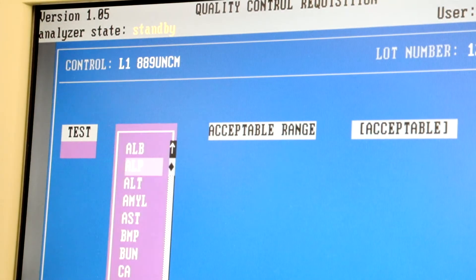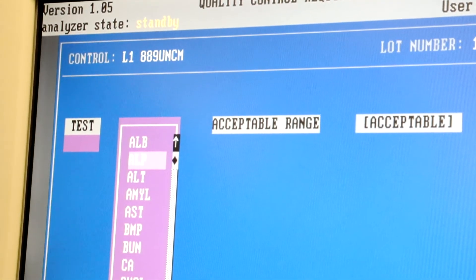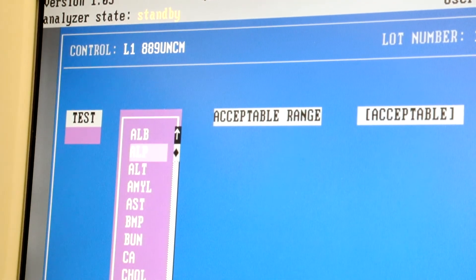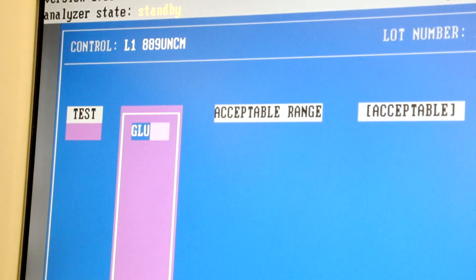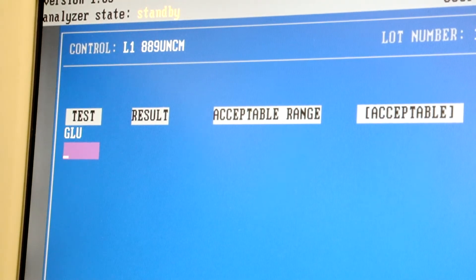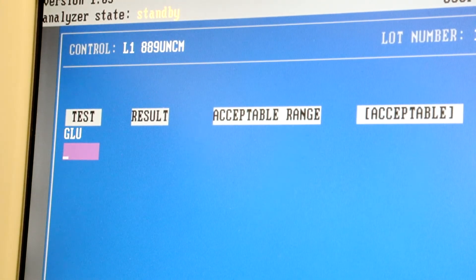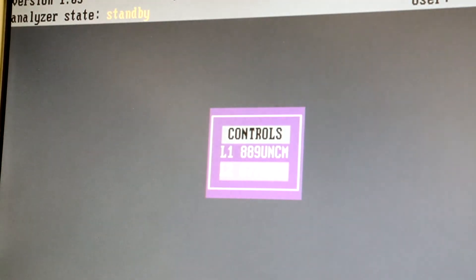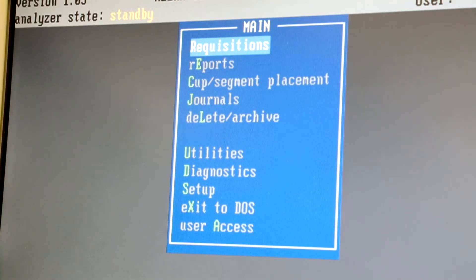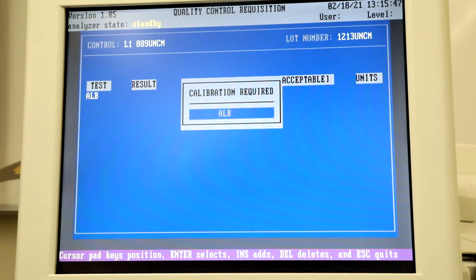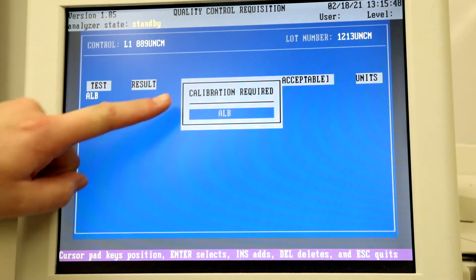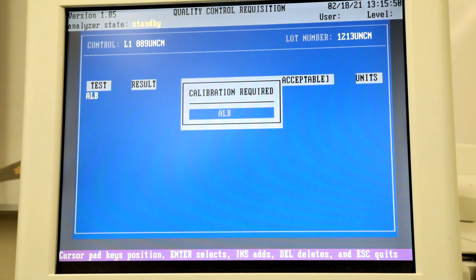Next select F12. This will pull up a list of possible analytes. Select the analytes that you will be testing then press Accept. Do the same with Level 2 and then select Escape twice to return to the main menu. It may flag that you need to calibrate an analyte.